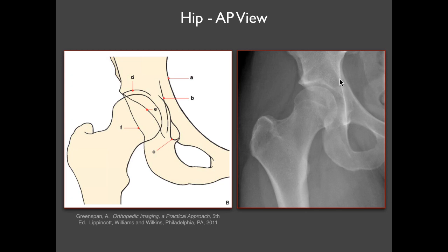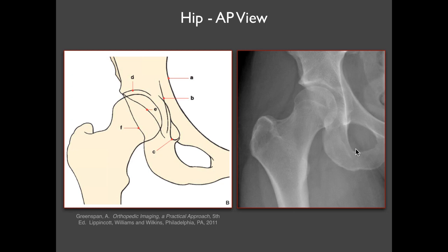A couple of other lines you want to look at on the hip radiograph: the posterior acetabular wall — it's a difficult structure to see because it's very faint sometimes — and here's the anterior acetabular wall crossing over the posterior wall just slightly. The A and B lines indicate the so-called iliopectineal or iliopubic line of the pelvis, and this line is the ilioischial line. Those lines are important to look at in terms of acetabular fractures and other disorders.